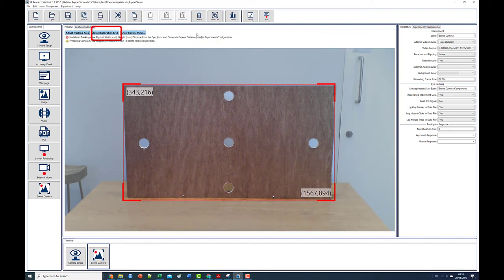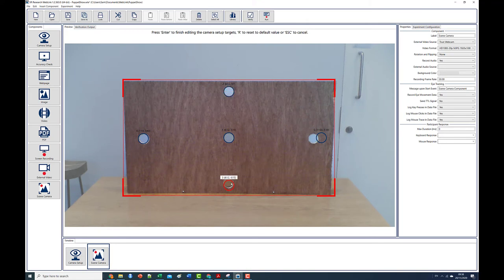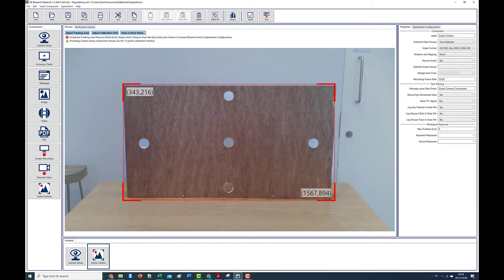Next click the adjust calibration grid button and move each calibration target marker so that it maps up with the corresponding location on the calibration board. Again press enter when you're done.